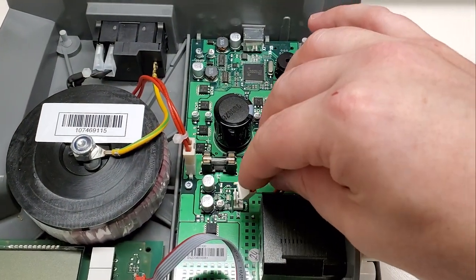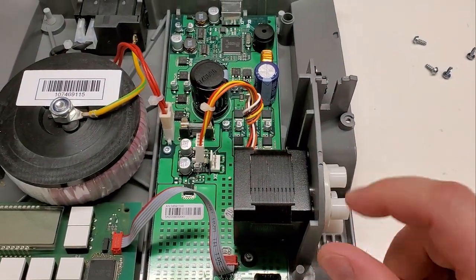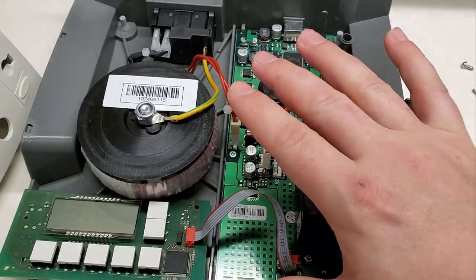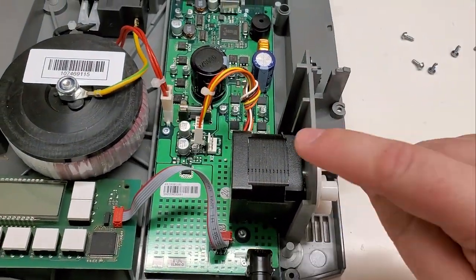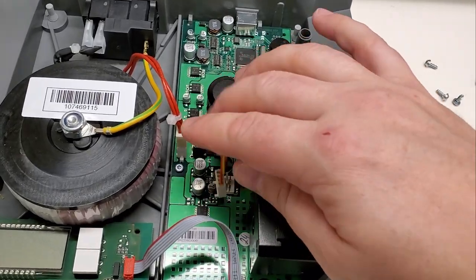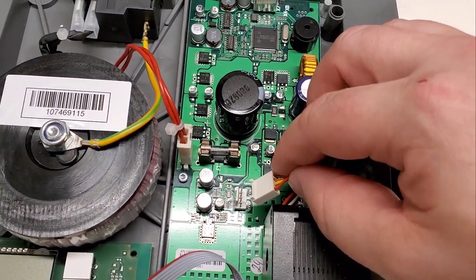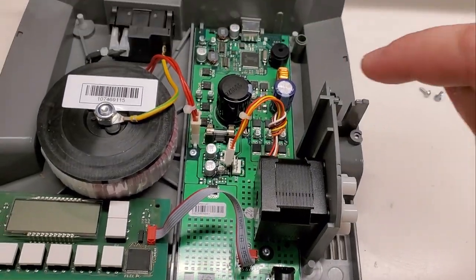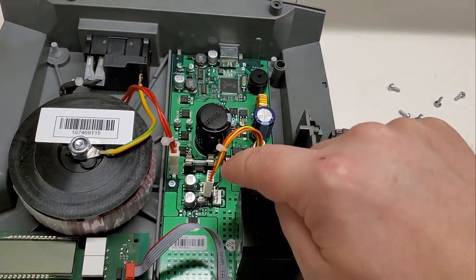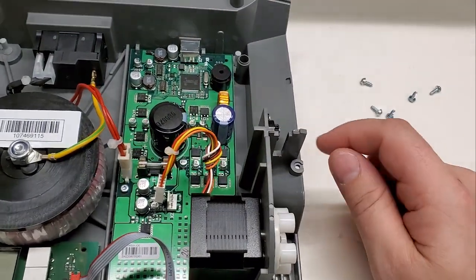So that's why it's very dangerous on most devices to sit here and spin them while they're connected to a motherboard. Now this unit is broke, so I don't really care if I'm inducing voltage back into the circuit. And I imagine that this guy has got a snubbing diode to prevent that onrush of current going backwards into the system from damaging your little CPU chip right here.